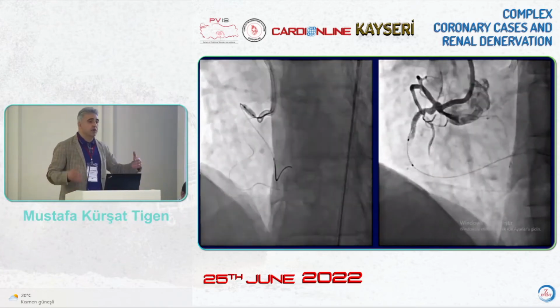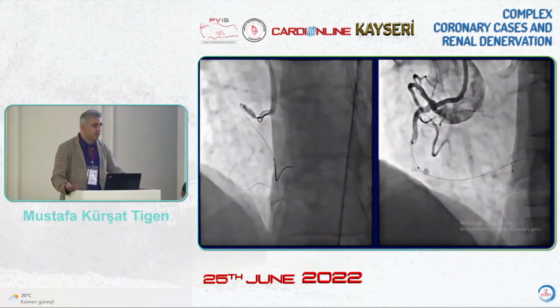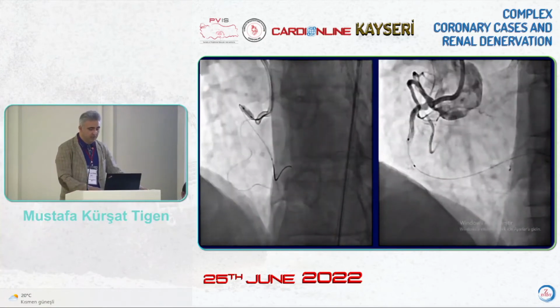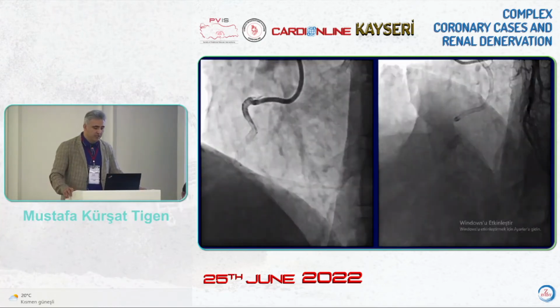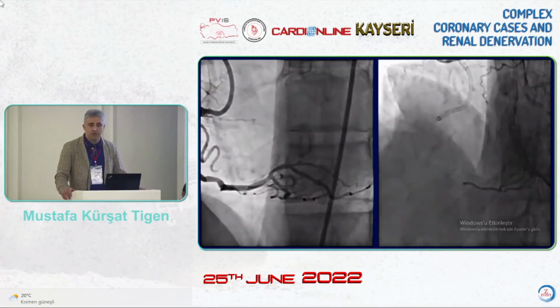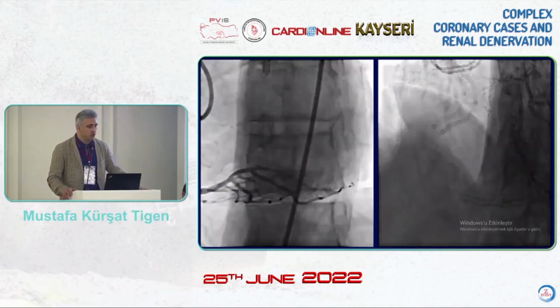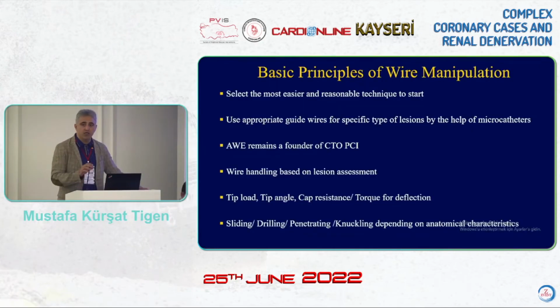You see the accordion effect, but we couldn't see where we would stand. So from the side branches, we have to compromise. This is the side branch that we want to save. We have the stent implantation. We have a large vessel with the retrograde injection. We see that it is jailed there, and clinically speaking, we received a very good result, and the patient is asymptomatic.